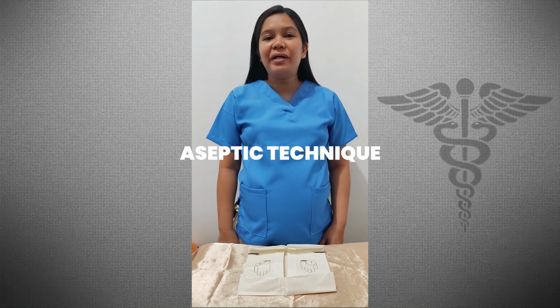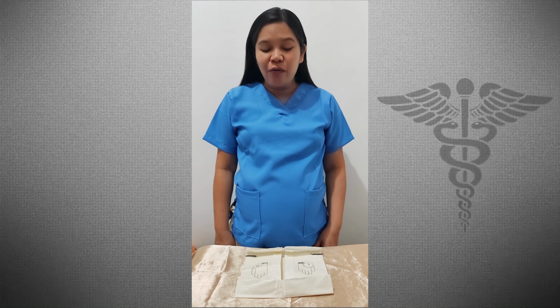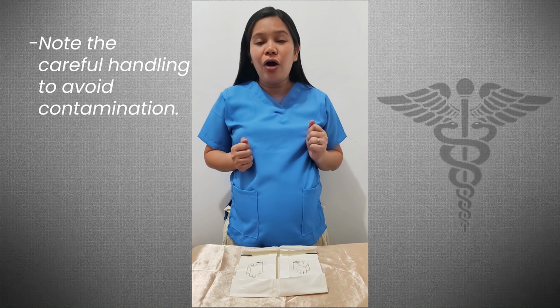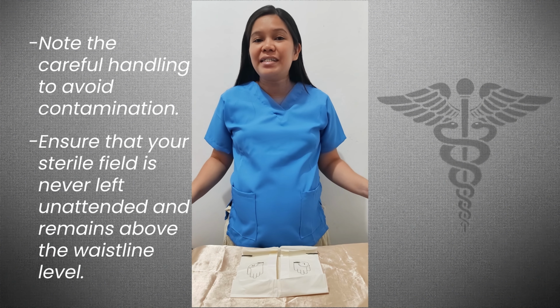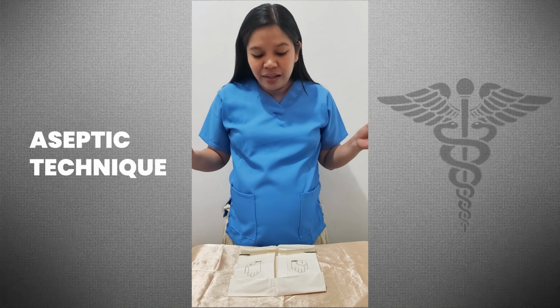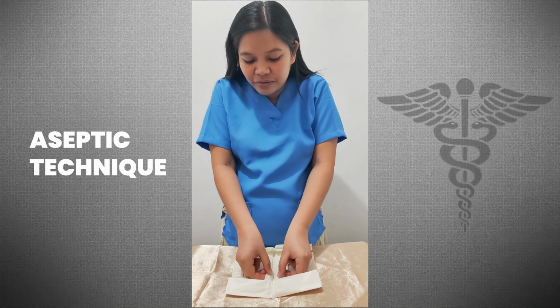This technique prevents the introduction of pathogens during invasive procedures. Now, I am going to don the sterile gloves. Note the careful handling to avoid contamination. Also, ensure that your sterile field is never left unattended and remains above the waistline level. So first, let's pull it open through its edges.